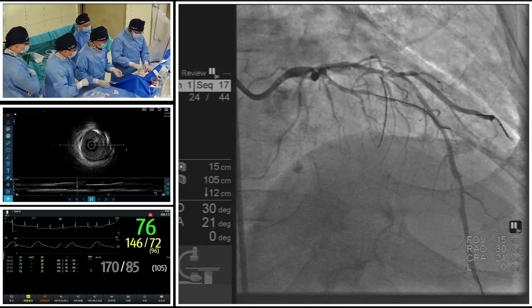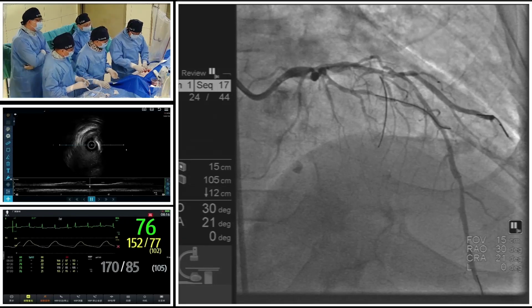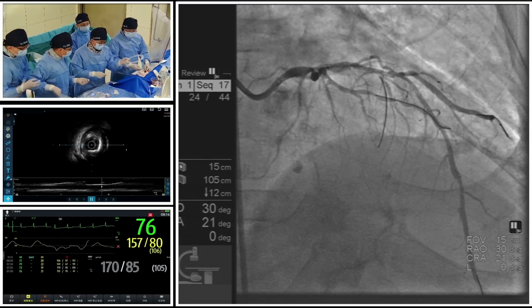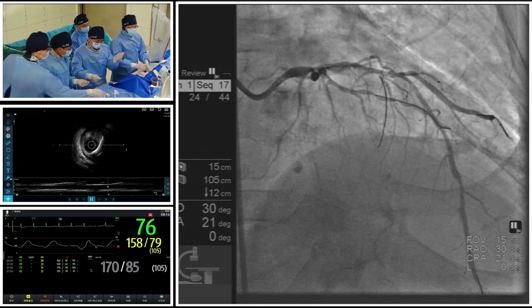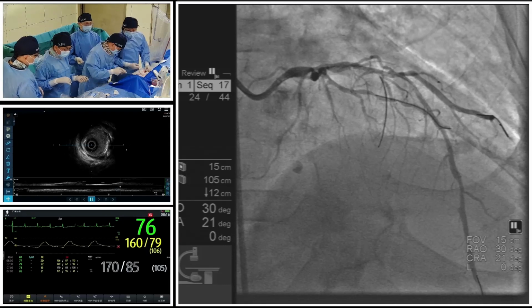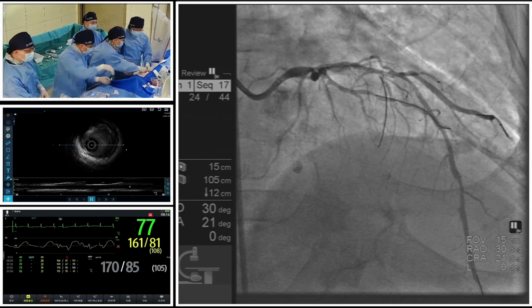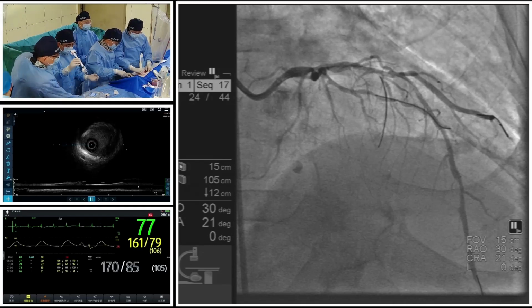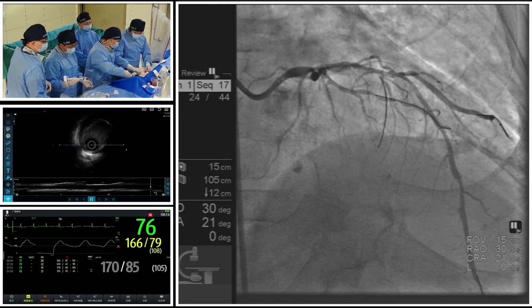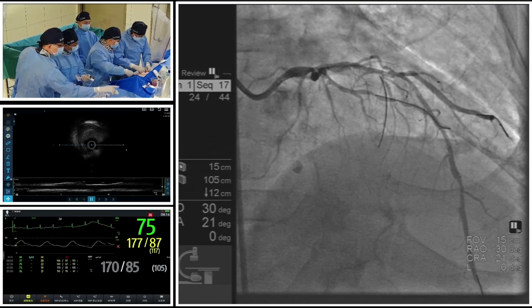However, using rotablation as a debulking technique to reduce the plaque burden and plaque volume at the trunk of the left main bifurcation is of great importance in this case, because we need to treat the distal LAD lesion first. If we use balloon-based plaque modification strategies, there is a high potential risk of causing a big dissection and plaque shift to the circumflex, which is not friendly for the following procedures. So this is why we perform rotablation first.